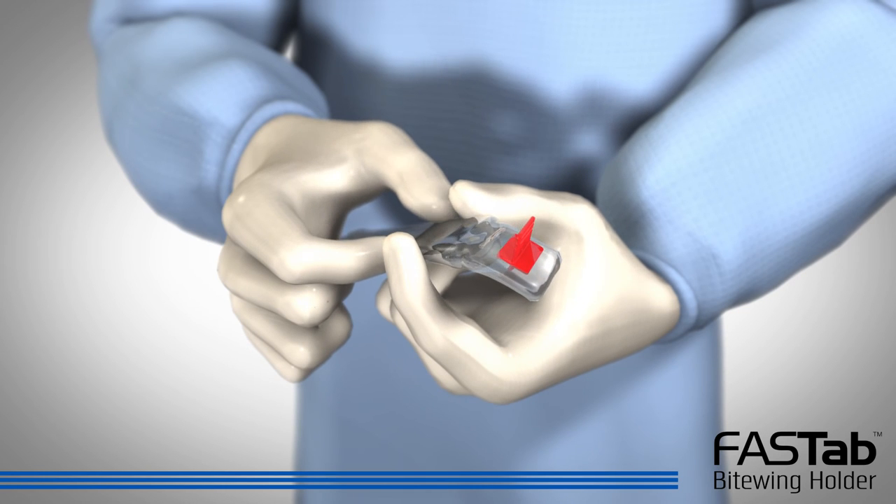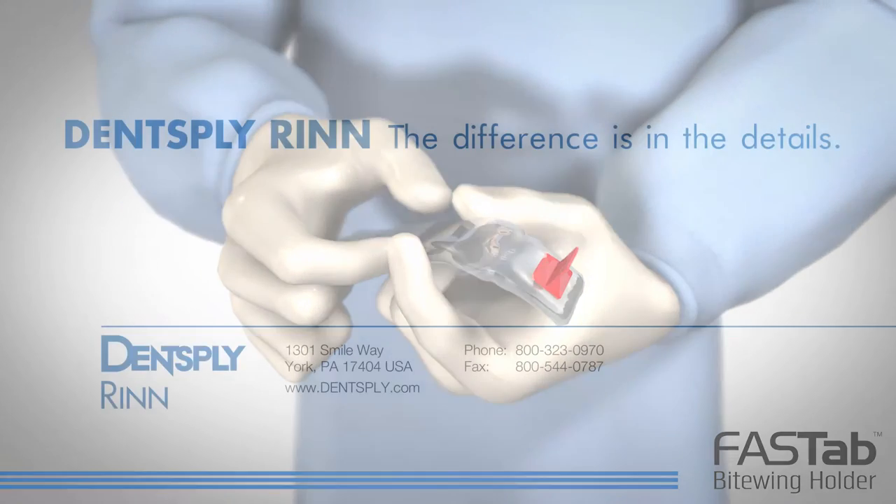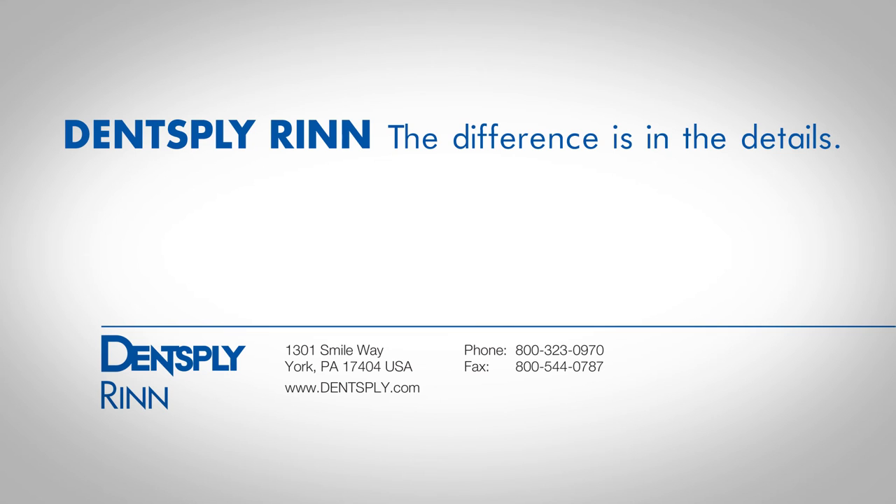Dispose of the holder and sensor cover. Dentsply Rinn — the difference is in the details.